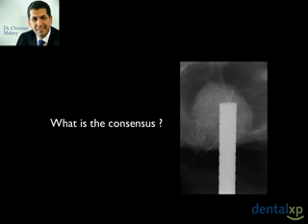In order to answer this question, I will show 5 clinical cases. And at the end, we will try to conclude and see if there is actually a consensus on when to use a lateral approach or when to use a crestal approach. Like for example, in this case, we have a 5 millimeter residual bone height.